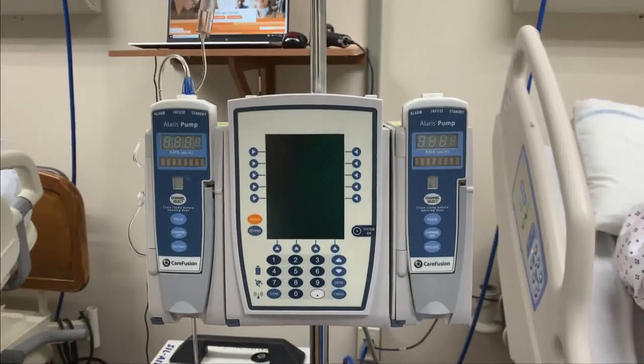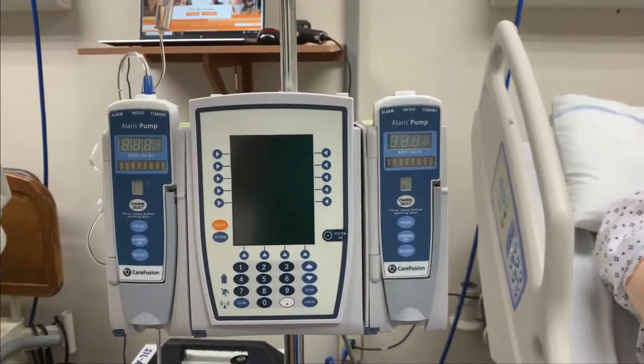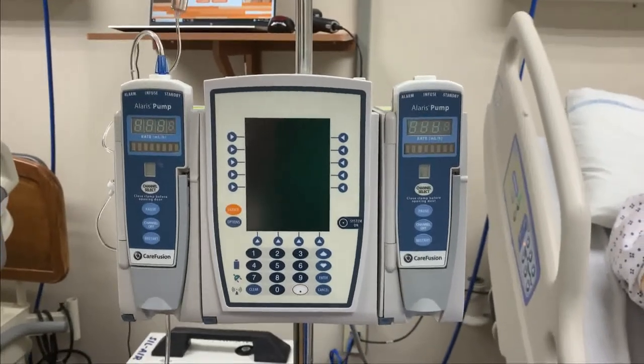This concludes your orientation video to the Alaris pump. There are other functionalities you may need to use, but that is just basic operation.